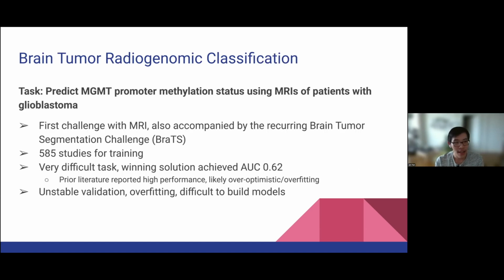So the next challenge was on brain tumors. Here, what we were trying to do was predict the MGMT promoter methylation status using MRIs of patients with glioblastoma. This is hard. If you ask a radiologist to look at a GBM and say, do you think the MGMT promoter is methylated in this tumor? They will have no idea, right?